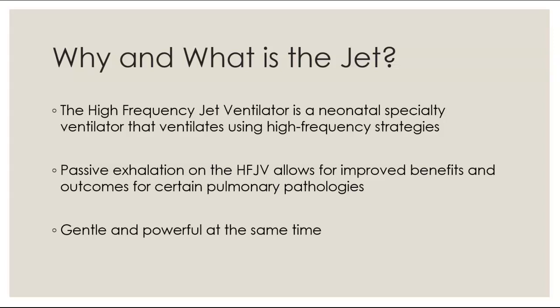And one thing to be aware of with the jet ventilator: if you want things to be fast, use the oscillator. If you want things to work over a long period of time, it's the jet. So the analogy I like to think of is, if you want a relationship that burns hot real fast, the oscillator. If you want a commitment that is a good, healthy relationship, think of it as a marriage. Think of the jet. It takes time to see benefits, but it's good benefits when you see them. I might be a little biased, but this is one of my favorite ventilators I'm telling you guys about.